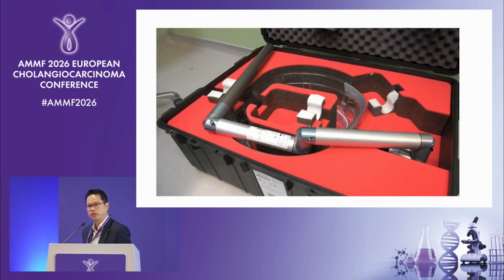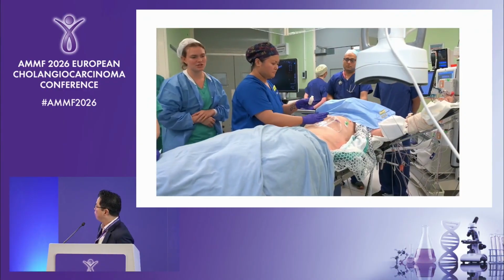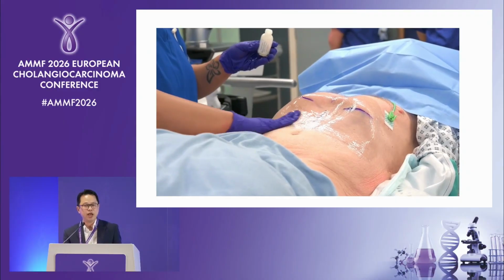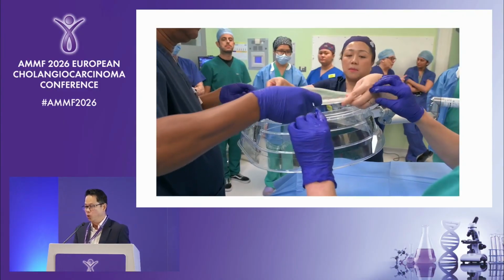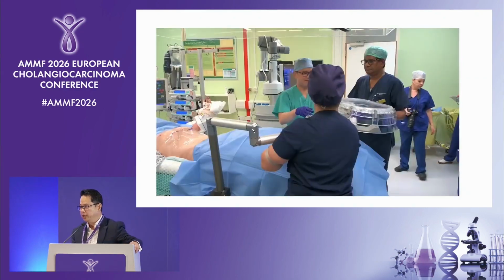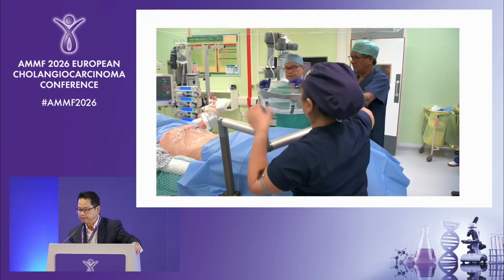And this is the robotic arm, which is attached to the system. We apply canola oil here, again, to avoid any air trapping between the skin and the water bath. And you apply the membrane, which will be turned around onto the skin.